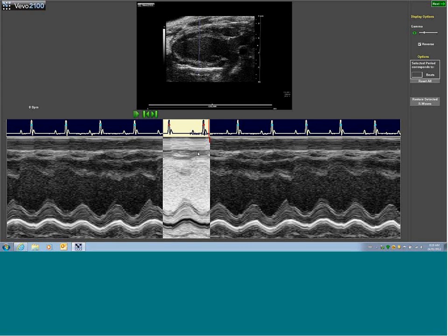What this will do is give me the option to select those R waves myself. So I'm in a place where I feel the R wave is best suited. So it's where I can select on my own. If I want to restore these R waves, what I hit is restore detected R waves and returned. So if you're happy with the cycles you've selected and the R waves that are present, you can then hit the next button.